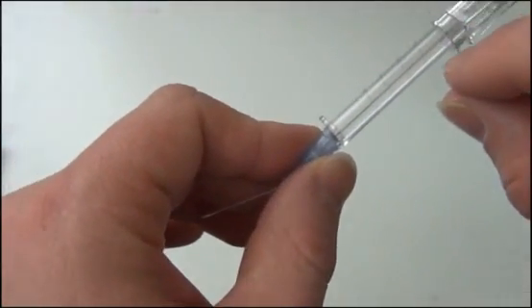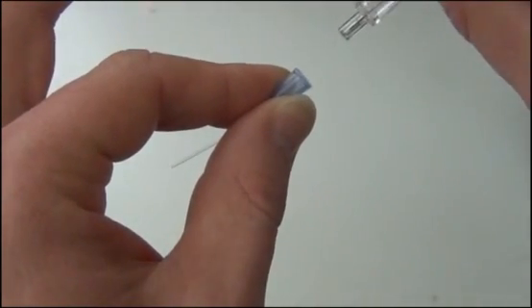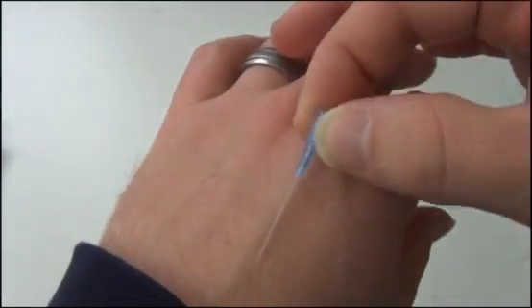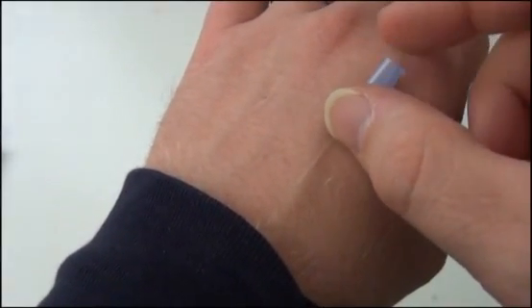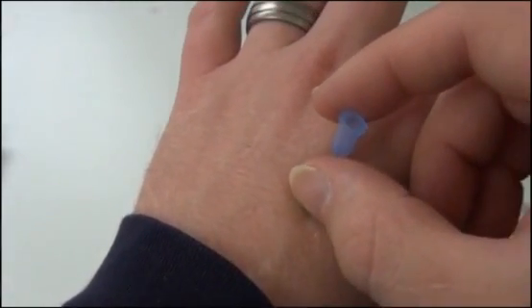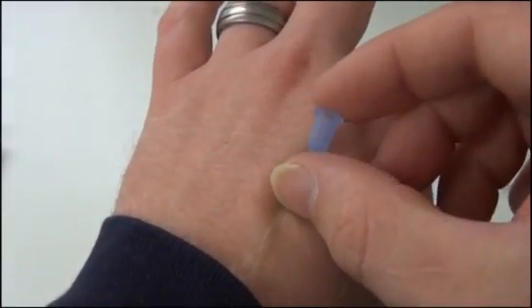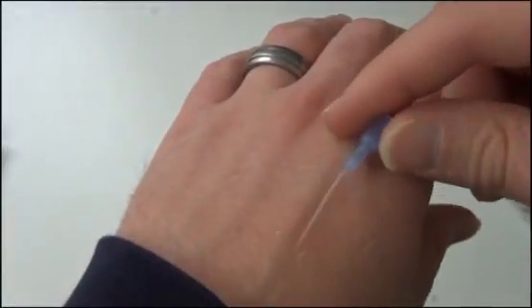So then you're going to have your J-loop and everything ready. And as you do that, you just twist right here. That comes off. There's your needle. And so this is all garbage. This is all sitting in the vein here like this. So, of course, what we need to do then is we need to connect our pigtail or J-loop, whatever you call it. So I usually bend it up a little bit like that to stop the blood from just squirting out everywhere. And depending on how good your IV is and how good of a stick you get, it'll determine kind of how much blood starts coming out. So you'll just bend this up, and you'll kind of connect. Of course, you'll be doing this with two hands. So you'll bend it up with one, and then you grab your pigtail, twist it on there real quick, and then you can kind of have that sitting there and flush it.